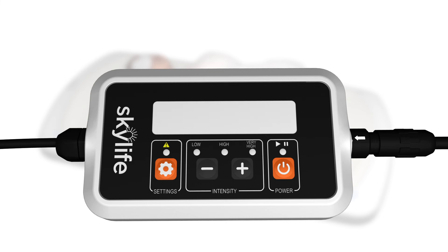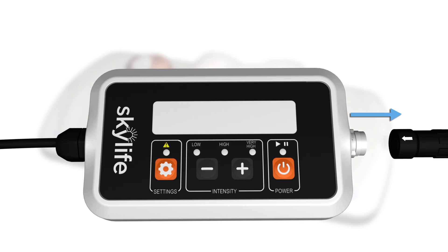In order to disconnect the controller from SkyLife, you will need to slide the cable sleeve away from the controller until it hits a stop. Once the sleeve hits the stop, you can easily slide the cable out of the controller. You may find it difficult to remove the cable if the sleeve has not slid down the cable enough. Do not attempt to force the cable out of the controller.